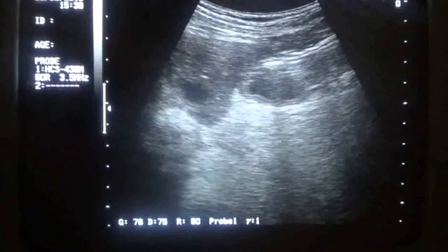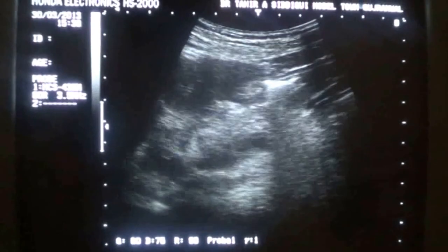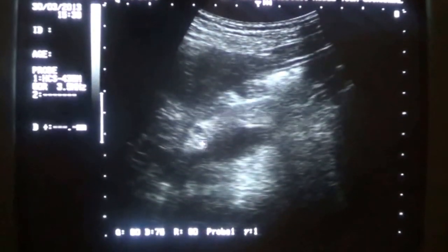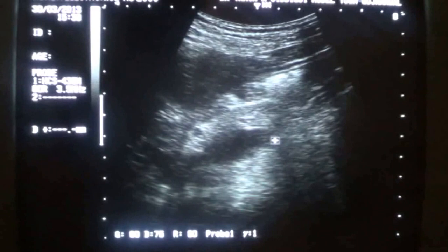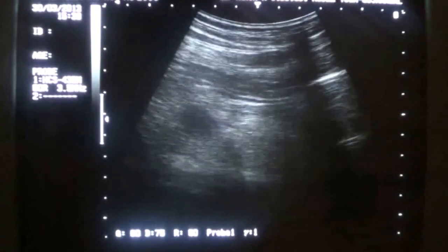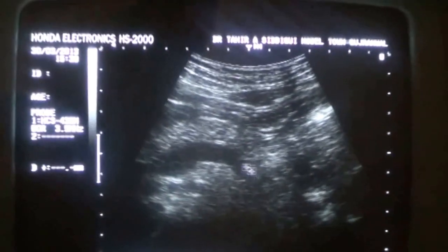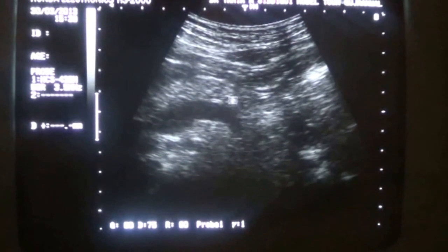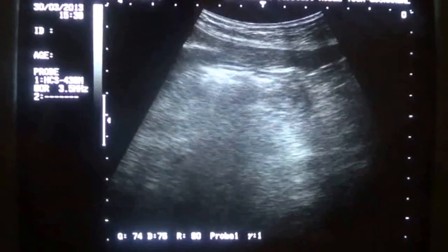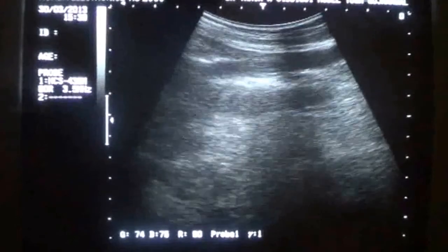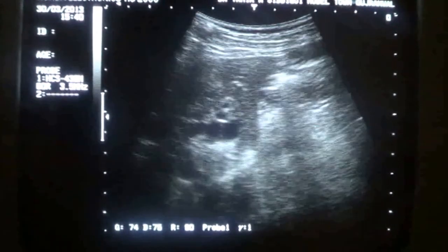We must assess the status of the pancreas in all such cases. This is the head of the pancreas, this is the body of the pancreas. We do not see any pathology relating to the pancreas. No pancreatic mass is seen as a cause of the mentioned pathology.